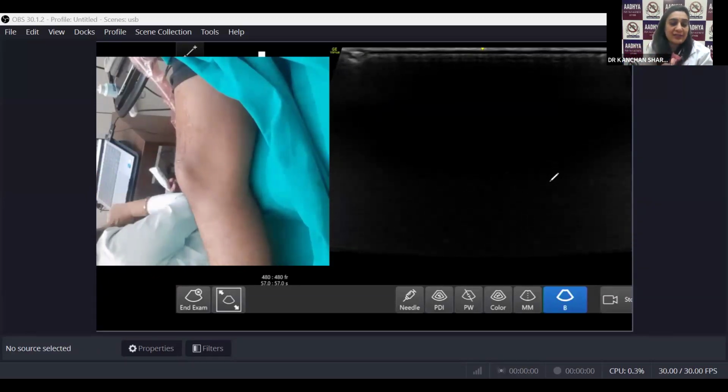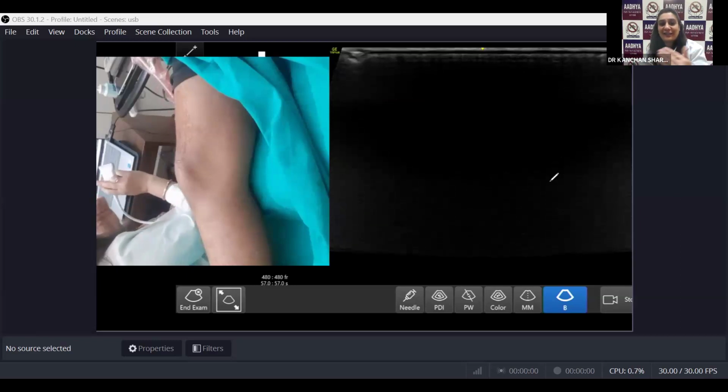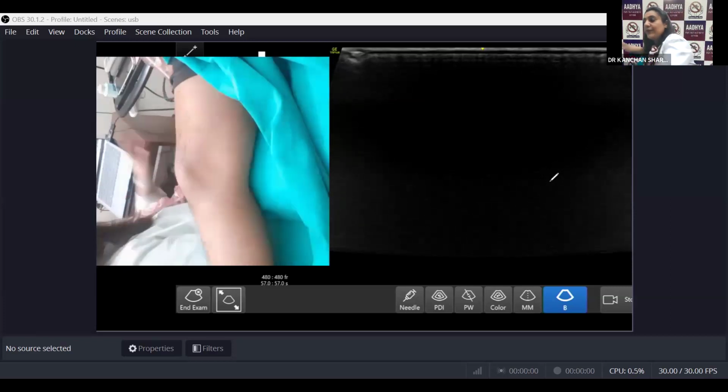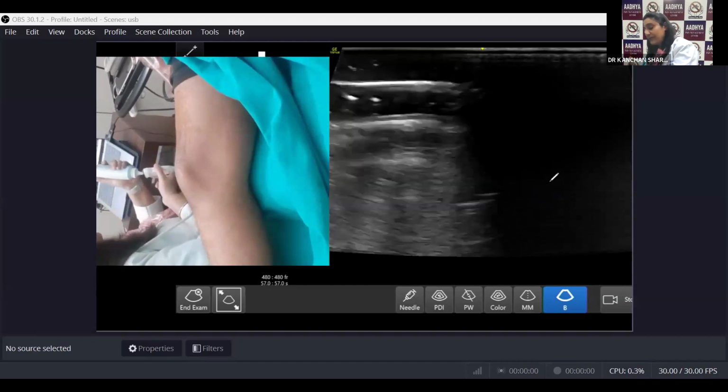This is what we have seen in the sagittal section. Third thing is you poke it from the lateral side. Okay. So the prefemoral fat will be dancing. And on the top, you will be able to see the recess. This recently I just read in one of the articles and I found it very good. So that is also one thing which you can follow. Right? So once you have seen everything there, now we will be moving to the vastus medialis.